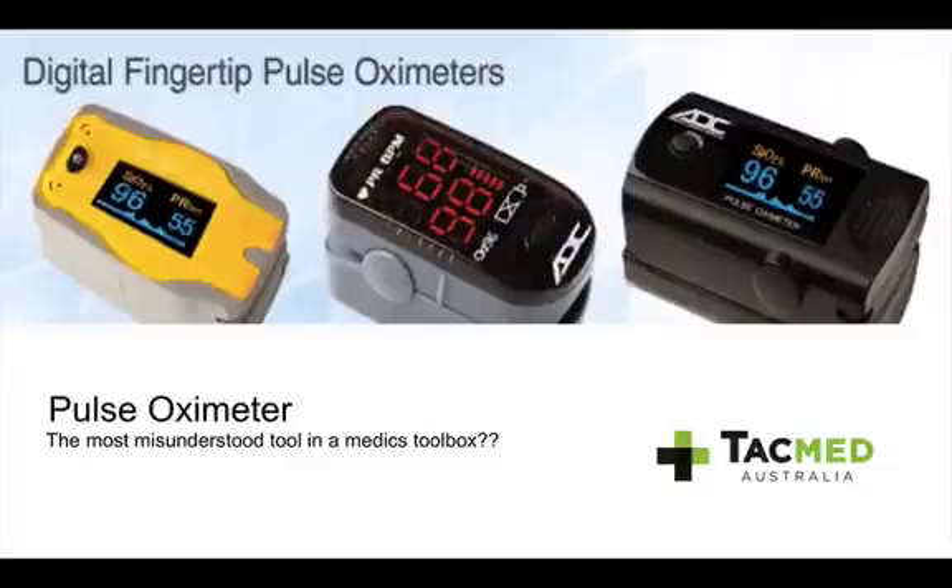Hey guys, Jeremy from TACMED Australia. Today we're going to do something different — a small online lesson on the pulse oximeter.